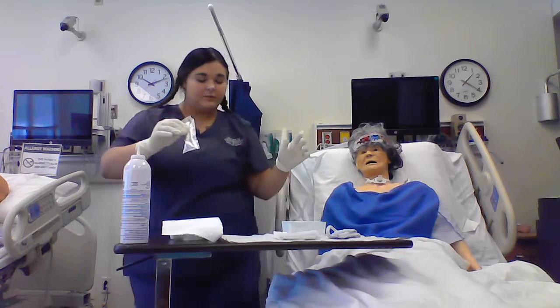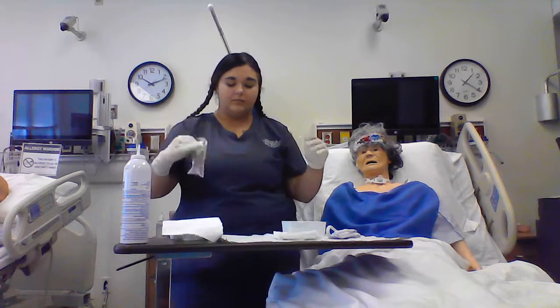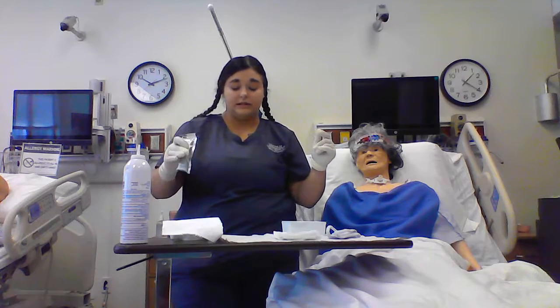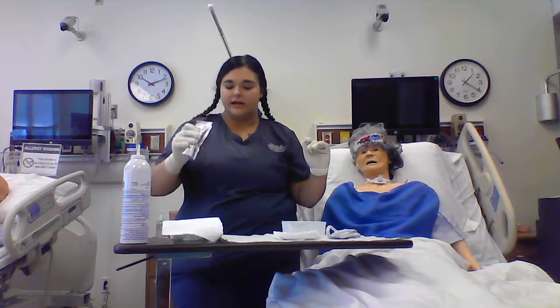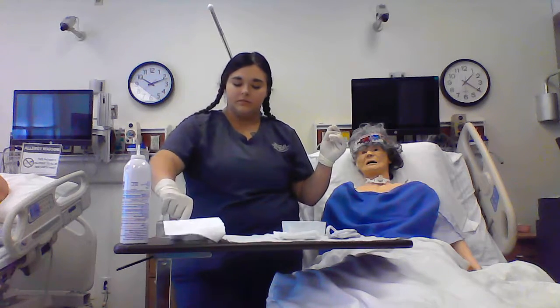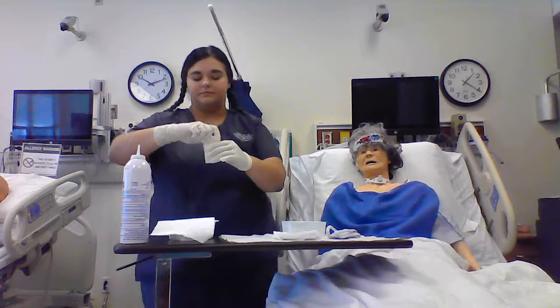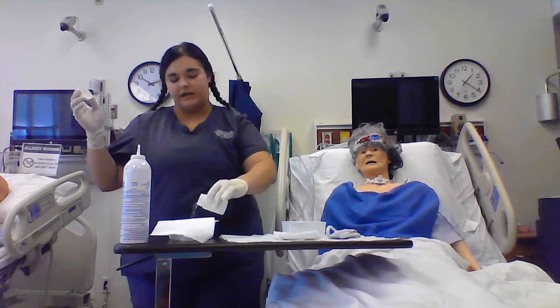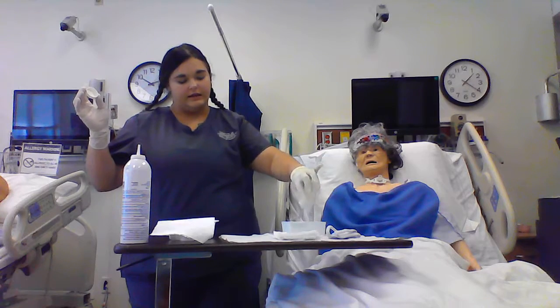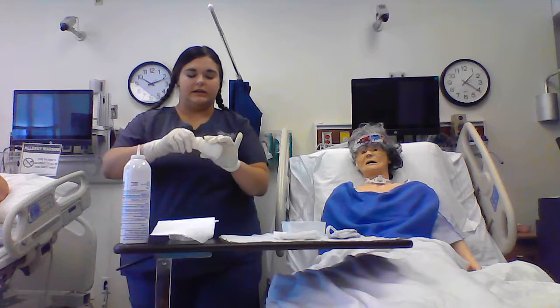Okay, at this point I have 2 containers that I will separate sterile saline between. I have hydrogen peroxide here. I'm going to go ahead and dump it in one of the containers. I'm going to grab my sterile saline. I'm going to put half in with the hydrogen peroxide and then the other half in the other container of just sterile saline.